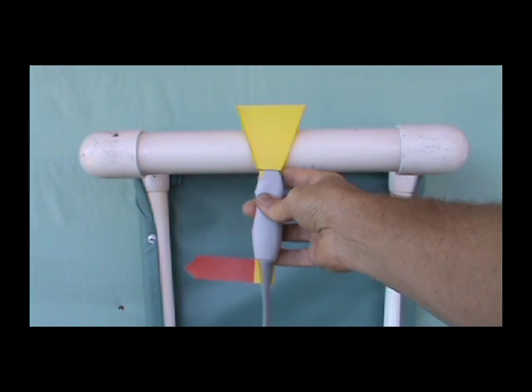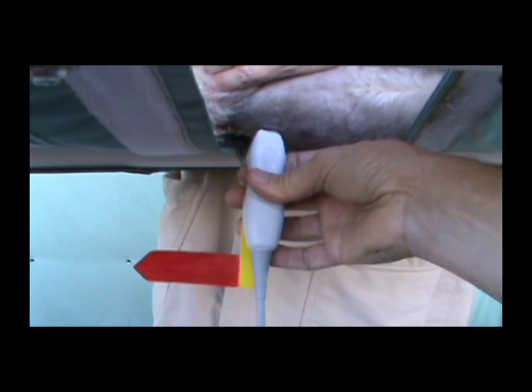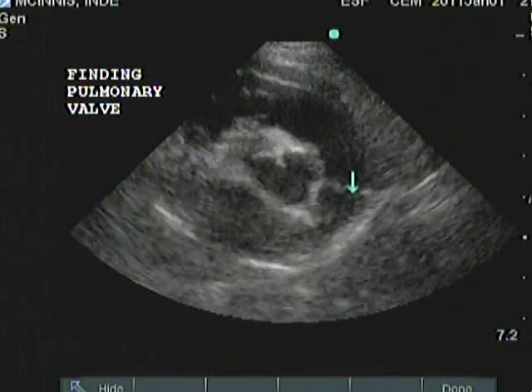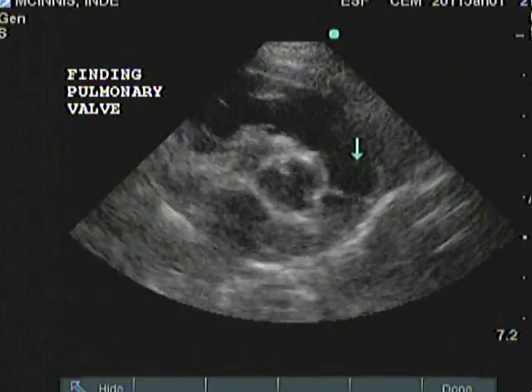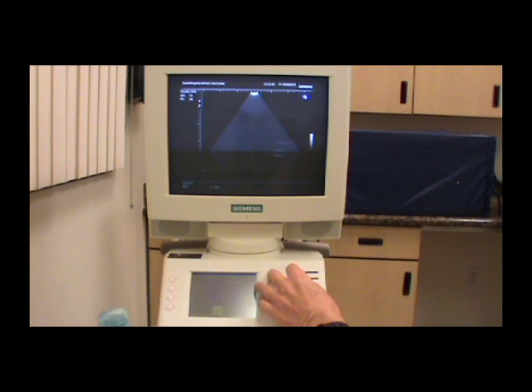In the General Cardiac Exam DVD set, I teach you how to use a transducer to move the ultrasound beam and find the proper positions for viewing the heart. I also teach you how to use the functions of an ultrasound machine to optimize the image.